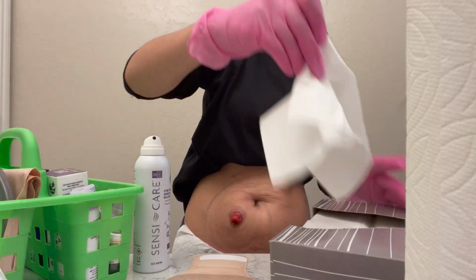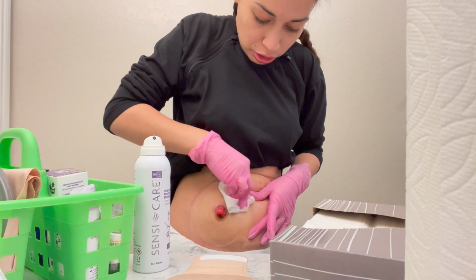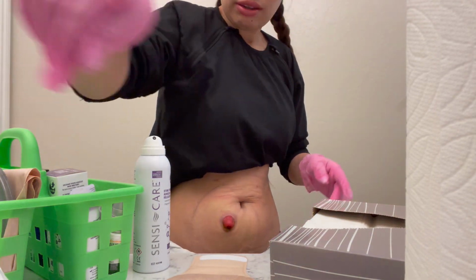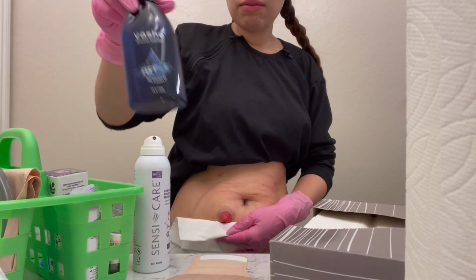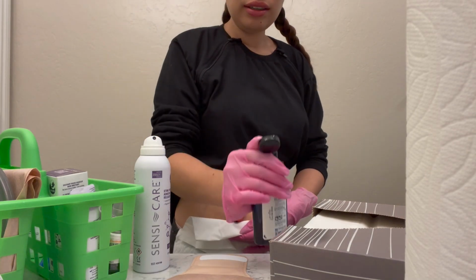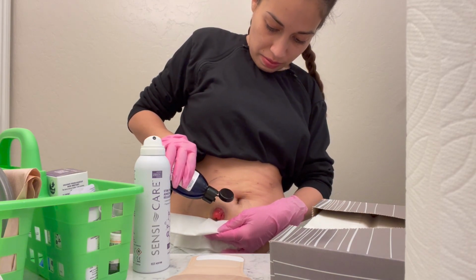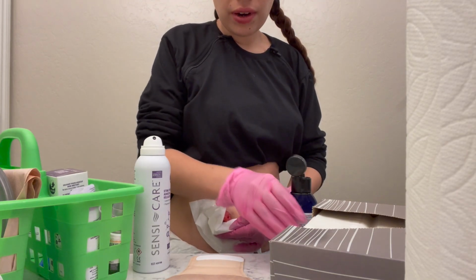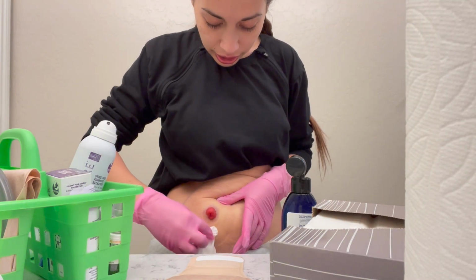Throw that in the trash can. Clean off the spray. Just be very careful when you go next to your stoma, because you can make it bleed very easily. And then I just gently tuck that under. They had given me this at the hospital, but I just filled it with saline. Or you could just put water in it. It's fine. Just wash it off. I don't rub it. I'm very gentle with it, so I don't hurt it, and it's not irritated or anything.